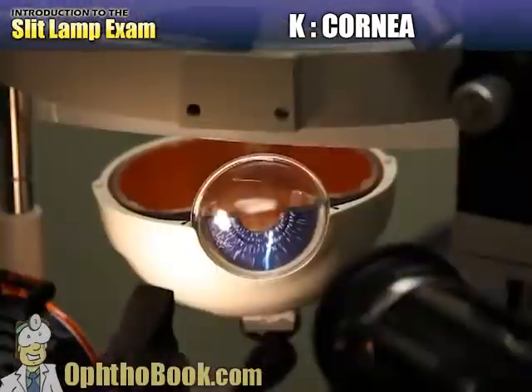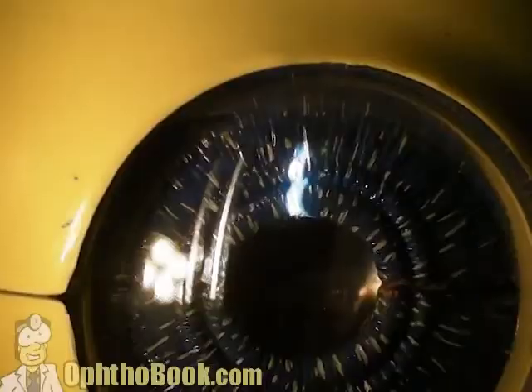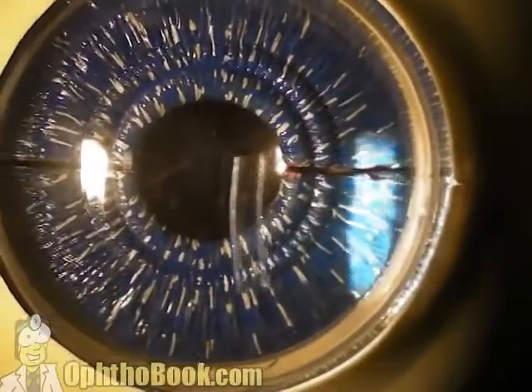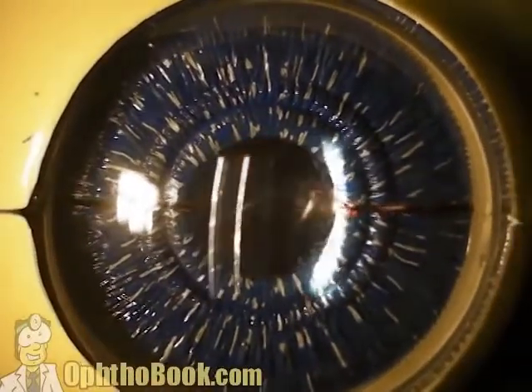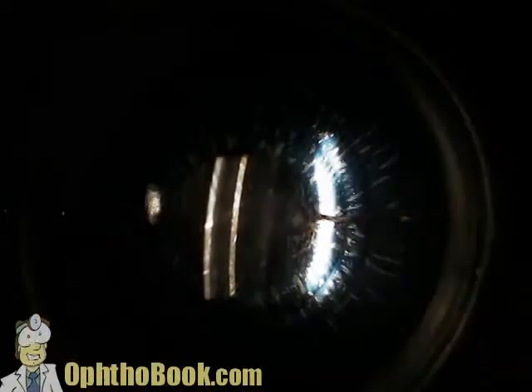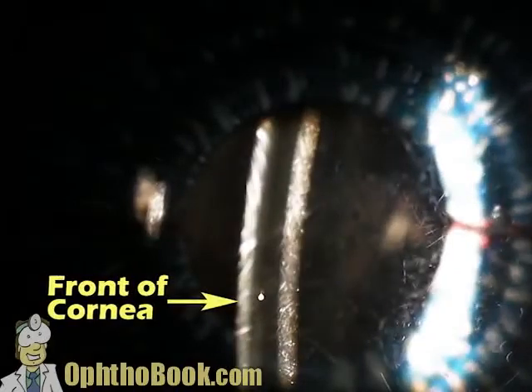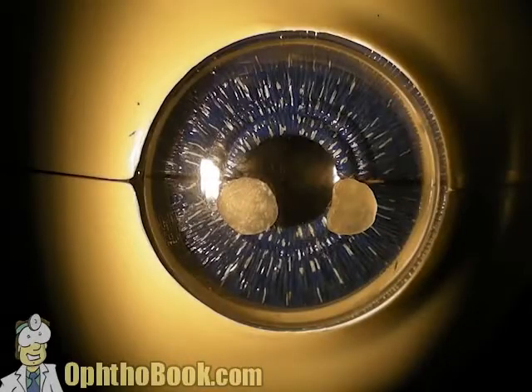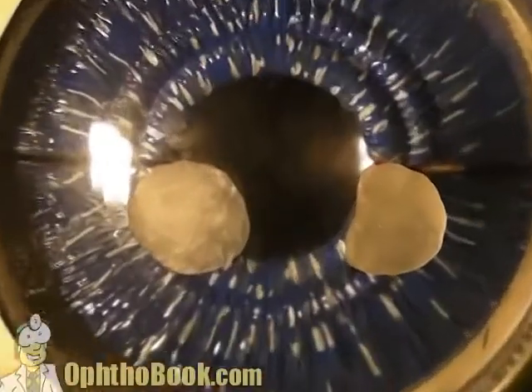We're going to switch to a different model to make it a little bit easier to see. And clear structures like the cornea really is where the slit lamp comes of age, because you can get a cross-sectional beam and look at that cornea in fine detail. And here you can see the beam is coming in from the left, and if you look closely, you can see the front of the cornea, you can look at the back of the cornea, you can look at the middle part of the cornea, and it's really nice to have that cross-section because it lets you track down lesions.